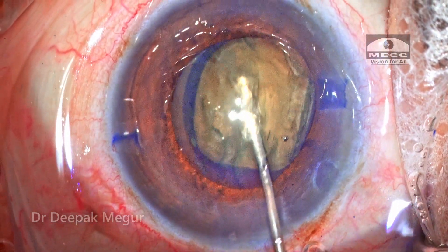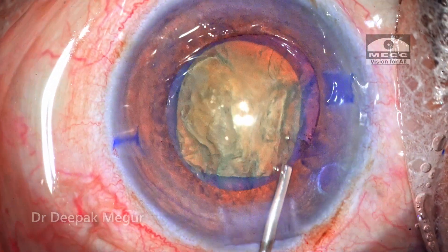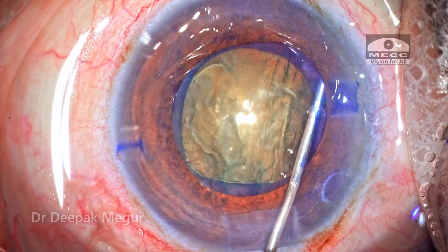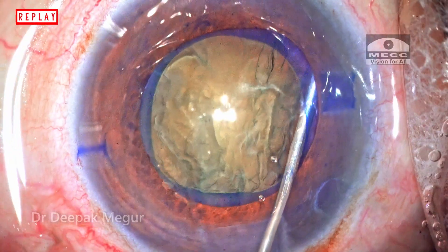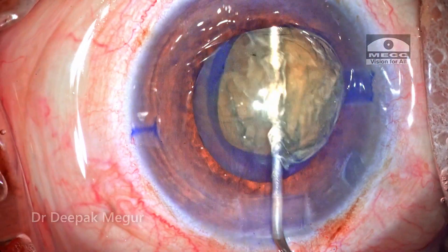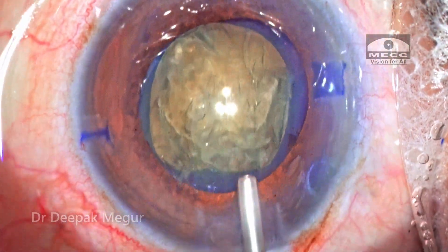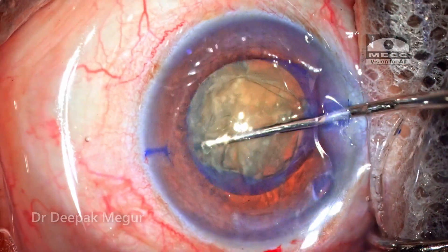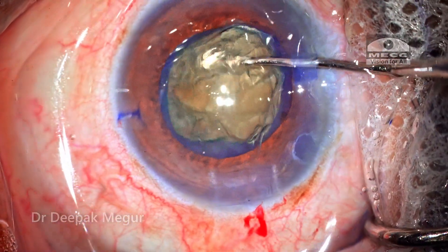At this moment I decide to repeat the hydrodissection. The hydrodissection cannula is introduced once again under the anterior capsule and hydrodissection is repeated. I can see that the nucleus is tipping up now, suggesting the hydrodissection is much more effective. Under the cover of viscoelastic, using a very sharp chopper, I rotate the nucleus to ascertain that only the nucleus-cortex complex is moving and not the bag.